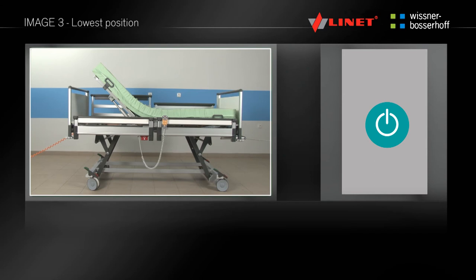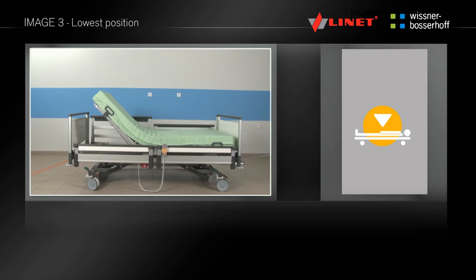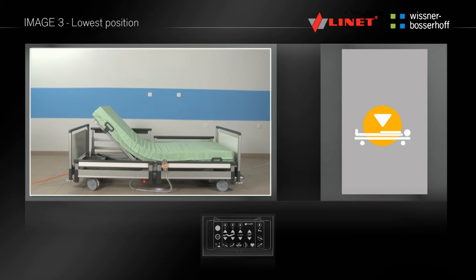By pressing and holding the button, you can set the lowest position. The backrest and thigh rest remain positioned, and at the same time the bed is being positioned to the lowest position. This function can be found only on the supervisor control panel in the area of pre-programmed functions.